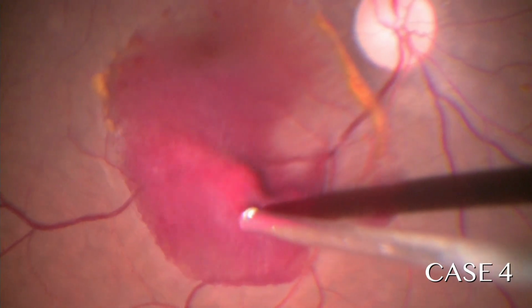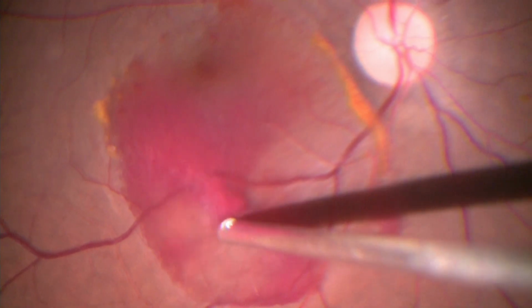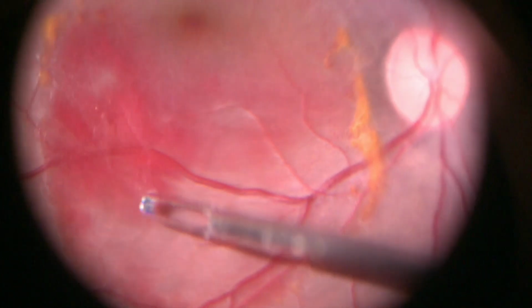This case seems to be a classic subhyaloid hemorrhage. The blood was aspirated using a cutter. However, we realized that some part of the hemorrhage was sub-ILM. At this stage, we removed the ILM using a forceps to further expose the residual hemorrhage.